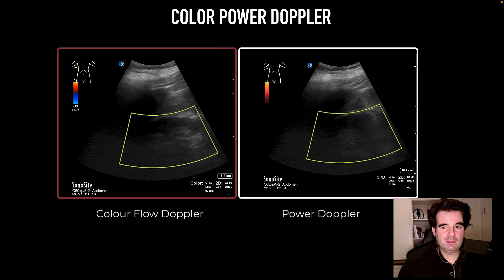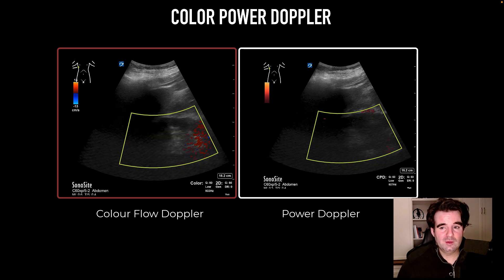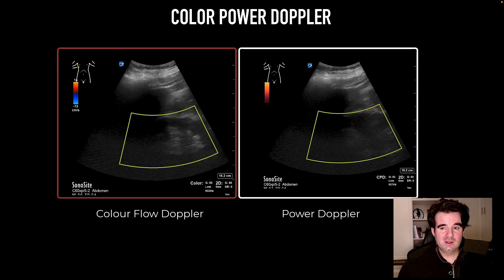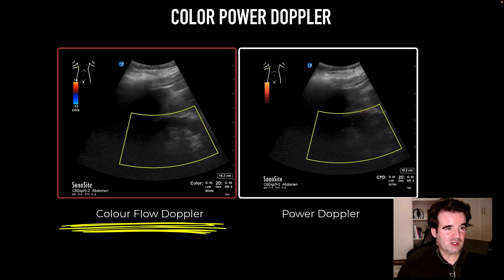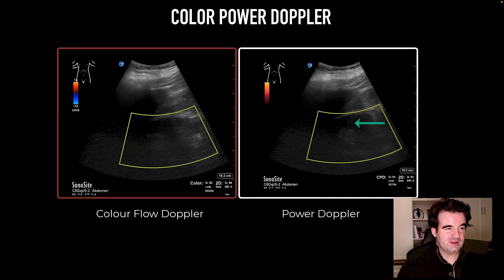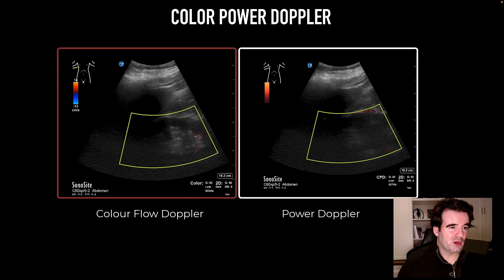Finally, Power Doppler. Power Doppler is the most sensitive kind of Color Doppler. It does not tell direction — really only flow — and it's independent of velocity, direction, and angle. So it's often used in technically challenging areas. Here I'm applying it to the kidney to look for evidence of flow. As traditional Color Doppler fails to register much, we can see tiny specks of flow within the kidney. The most common place I would use this would be on the abdominal wall prior to paracentesis, if the abdominal wall is fairly thick.